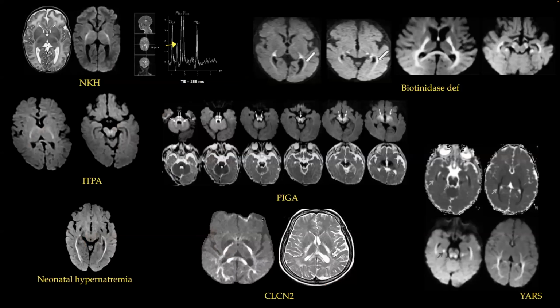And if you look at the MRI changes, these are the various differentials. Spectroscopy wasn't done for this child or wasn't available, but the symmetrical changes along the corticospinal tracts, pyramidal tracts, these are the various differentials. Just tying in the clinical information, I thought of a possibility of biotinidase deficiency, if it matches the skin changes or not. We'll just get to that.